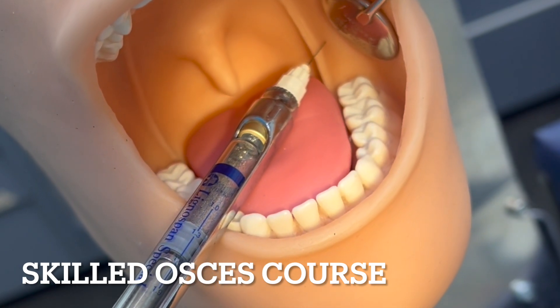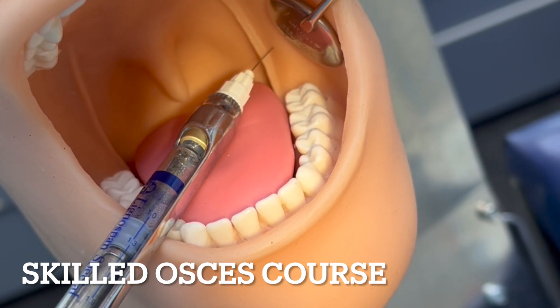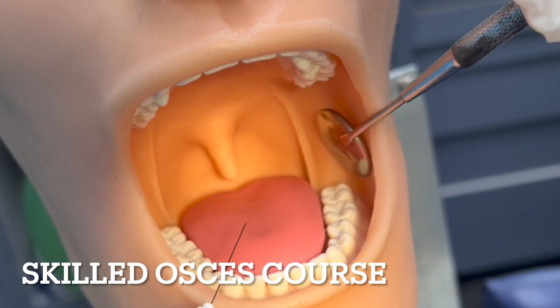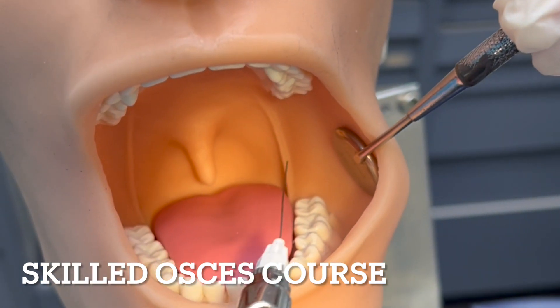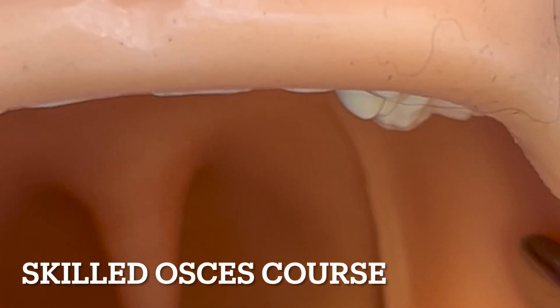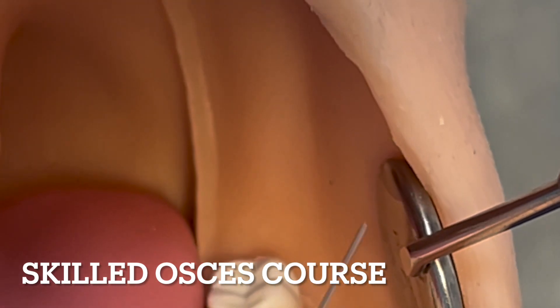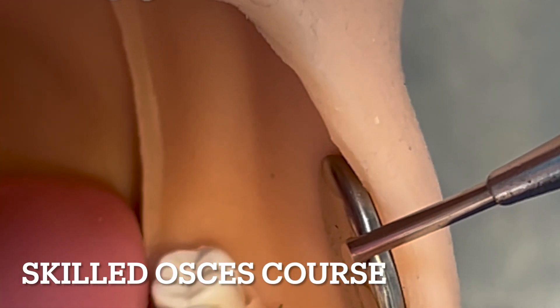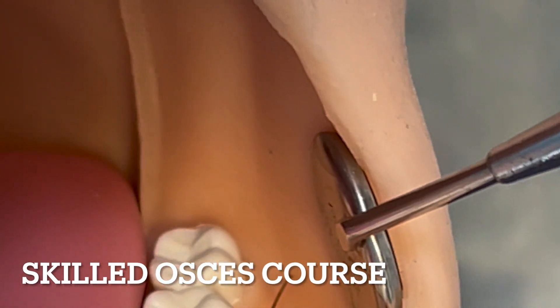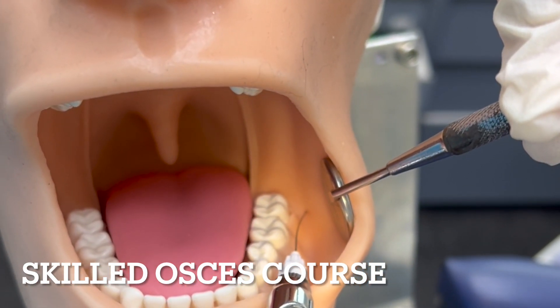For the rubber dam we need the buccal as well. So after injecting two-thirds — make sure you inject very slowly — you pull out to the buccal. Depending on which tooth you're working on, for example if working on molars, you keep retracting and inject the remaining amount superficially in the vestibule.